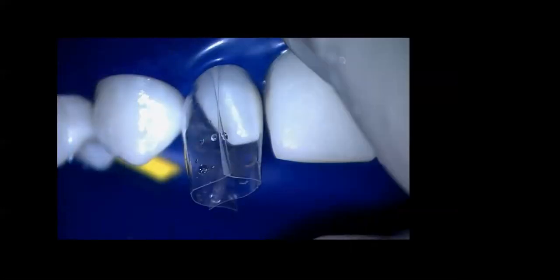Here we are with the Bioclear aquarium. We like to call this the aquarium. Once we wrap the tooth with the Bioclear matrices and stabilize them, it allows for injection of heated composites. We put in adhesive as a surfactant, and then flowable, and then paste. When we surround the tooth with the matrices, it basically crowns the tooth. The polymerization shrinkage is favorable, actually. We like polymerization shrinkage in the Bioclear method in many applications because it puts the tooth into compression. We shrink wrap the tooth, as we say.